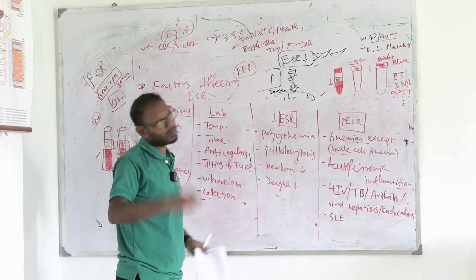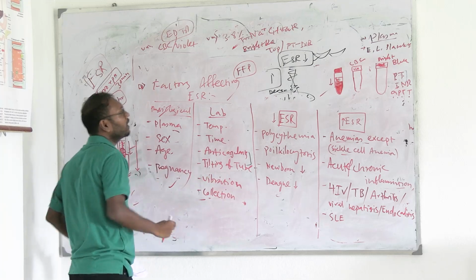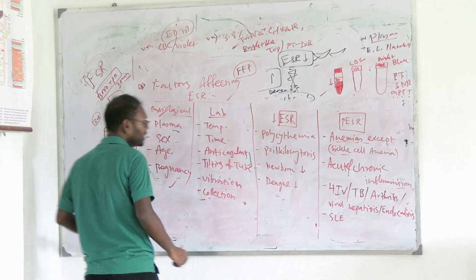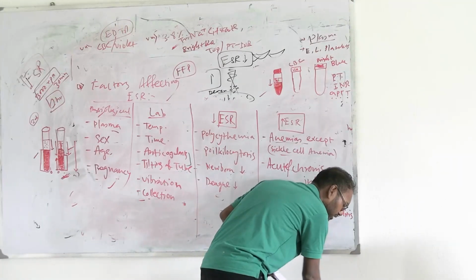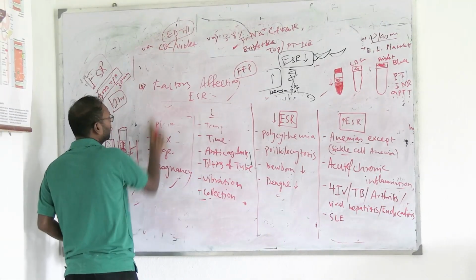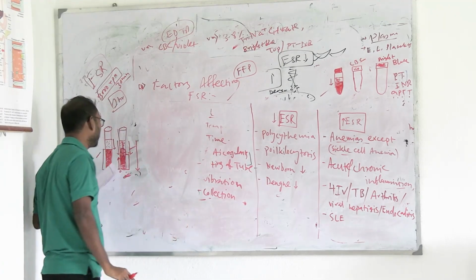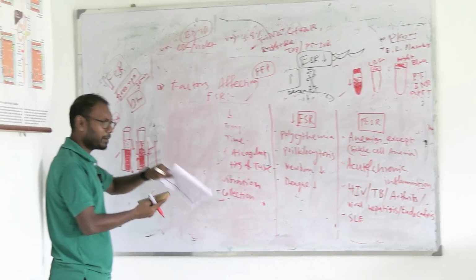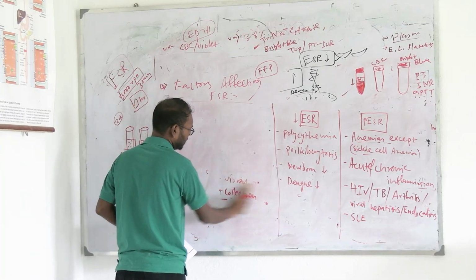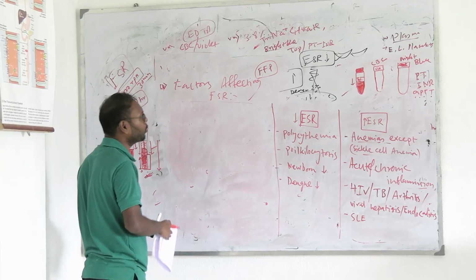এই প্যাথোফিজিওলজি গুলো তোমরা পরে বড় হয়ে পড়বে, এখন বললে একসাথে গুলিয়ে যাবে। আপাতত এইগুলো মনে রাখো। এখন আমরা যখন পিসিভির কথাও বলেছি, আমরা একটু শুনে নেব যে পিসিভি কেন বাড়ে কেন কমে, কয়েকটা রিজন। ইএসআরটাই মেন ফোকাস, বাট এত কিছু যখন বলা হলো উইল কমপ্লিট উইথ পিসিভি। প্যাক সেল ভলিউম কি, কিভাবে প্যাক সেল ভলিউম আমরা মাপি, বোঝা গেল। নাও উইল বি ডিসকাসিং সাম few reasons of having higher PCV and lower PCV.